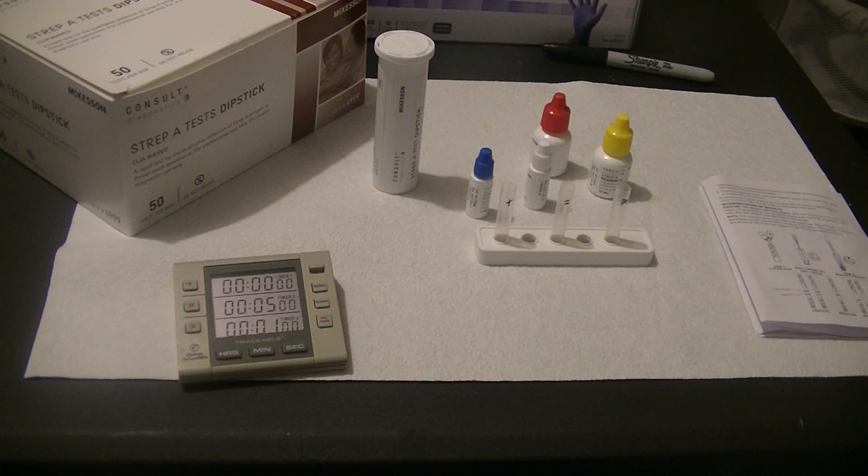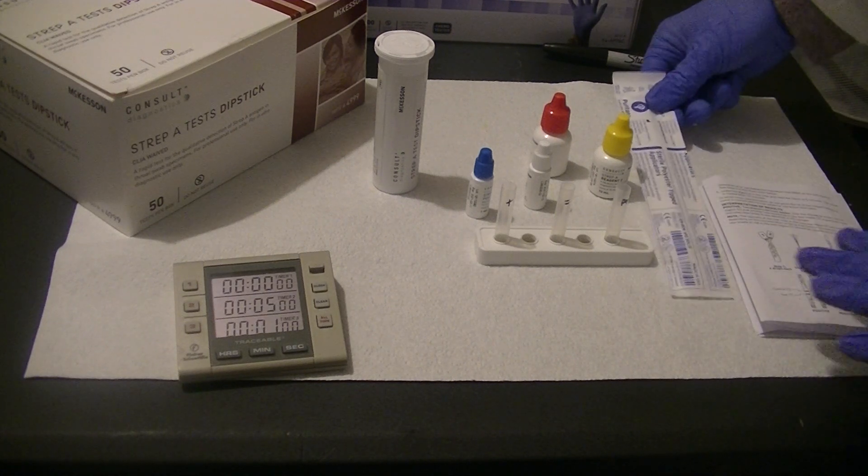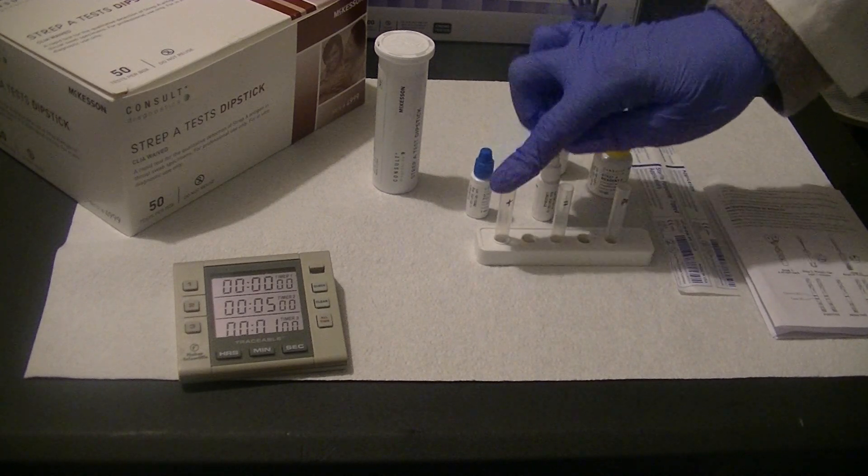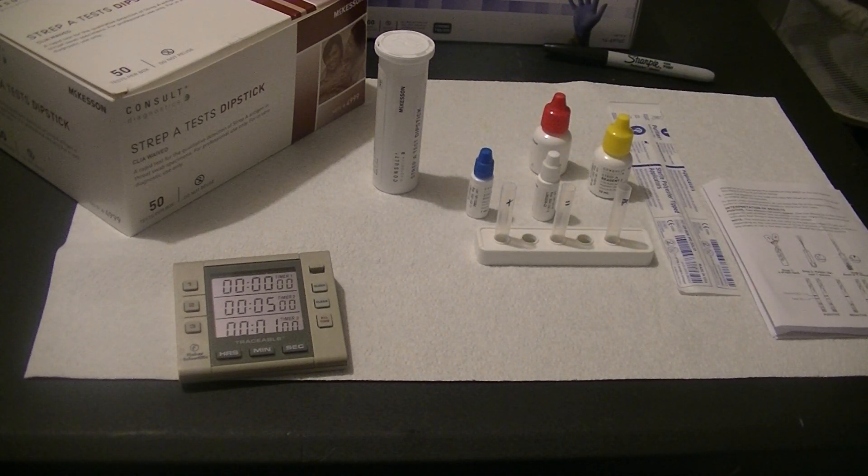When I take this throat swab sample from myself, I'm going to be putting it into reaction tubes or extraction tubes, just the same as I would positive and negative control.